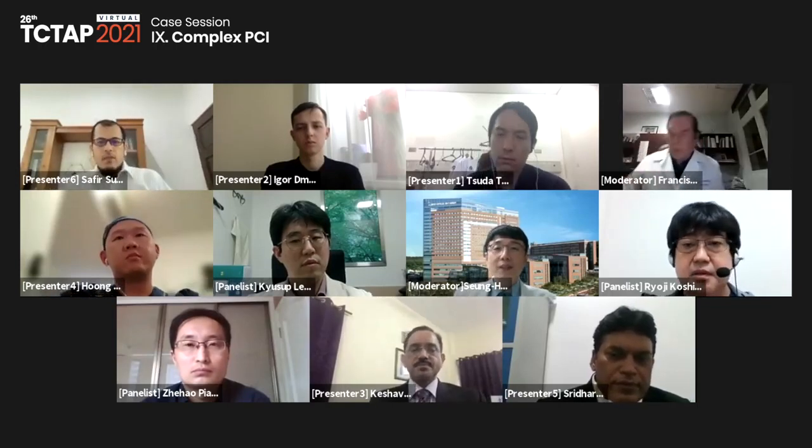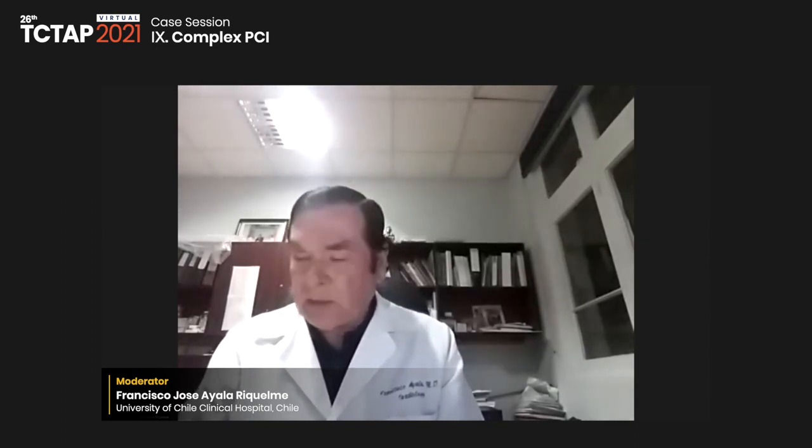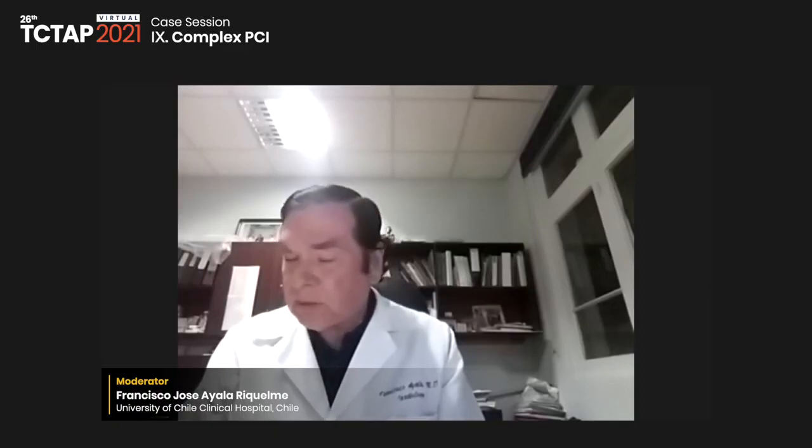Thank you, sir. Dr. Murthy, congratulations for this educational case. As you say, it's a little bit infrequent to see late ventricular septal ruptures, and most of them occur in the acute phase. And it's really a problem to just use devices, and also for the surgeons because of the friable margins. And sometimes we use these devices, but we are not sure that we have to use another device after, because sometimes you can find a residual shunt that you have to close again.